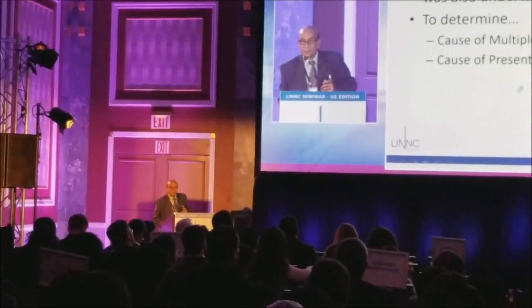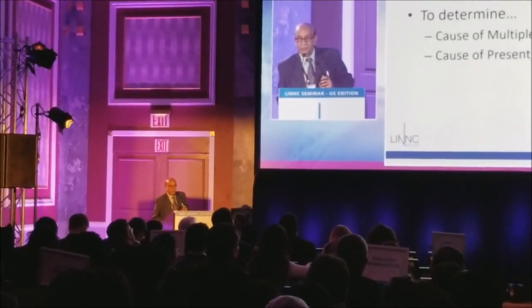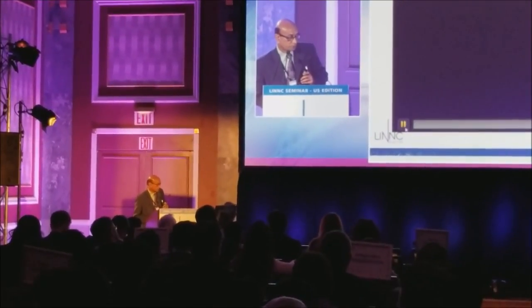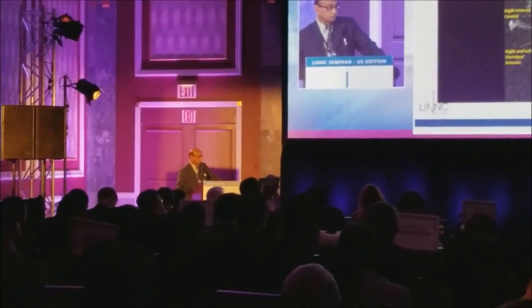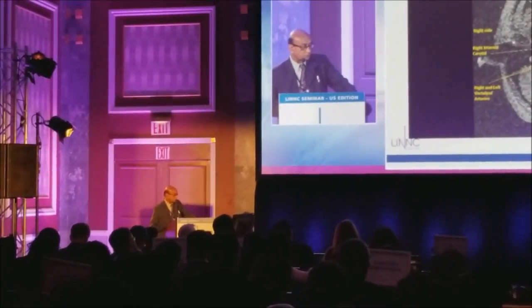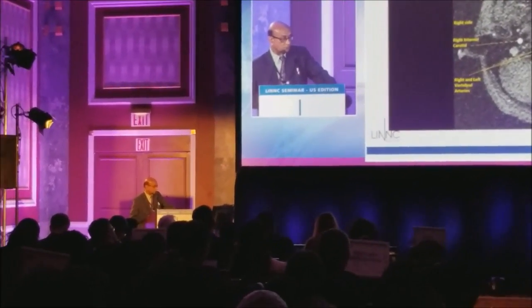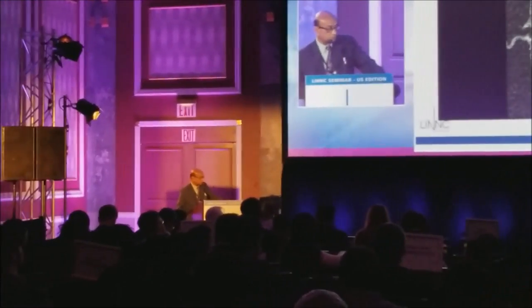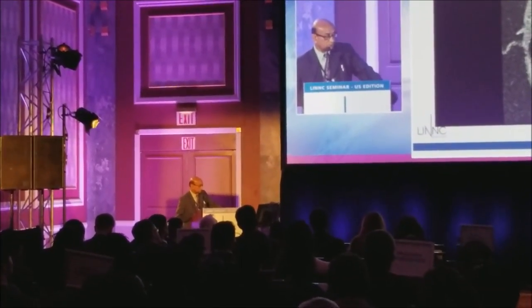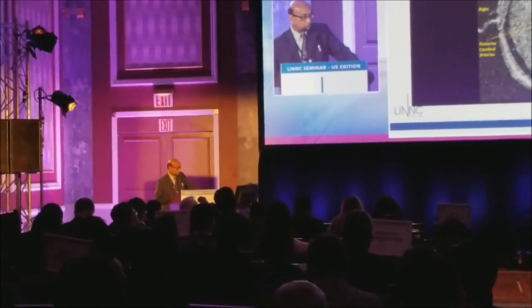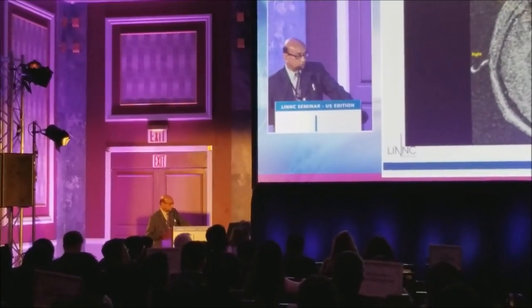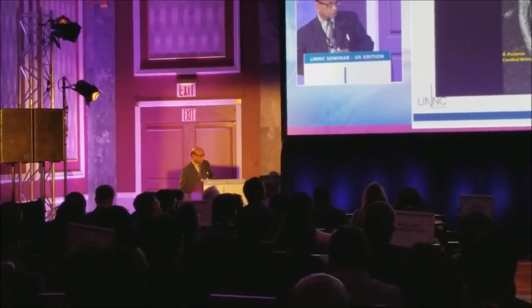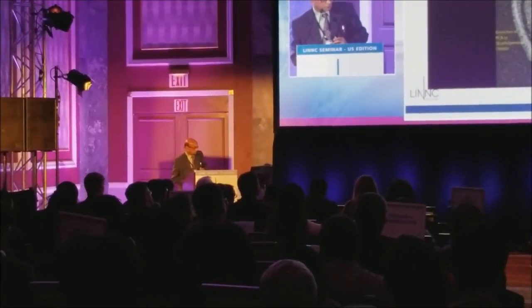So we did a 2-dimensional time of flight spoiled gradient recall echo acquisition of the carotid circulation also, just to make sure what was the problem. Take a quick look at this video. This is the fourth video of the series — spoiled gradient recall echo acquisition. Let me show you the carotid circulation. The vertebral artery on the right side is still narrow, as we had mentioned earlier. Now we can see the carotids in the carotid canal, corresponding to the temporal bone. Now the carotids are entering the middle fossa. The carotid is in the cavernous sinus. Here is the carotid siphon, which is in a 180-degree bend. Now the carotids are in the central part. We can see the middle cerebral artery, and the carotid artery is dividing into the middle cerebral artery running in the lateral fissure of Sylvius, and the anterior cerebral artery. Here we can see the anterior and middle cerebral arteries, which are normal.